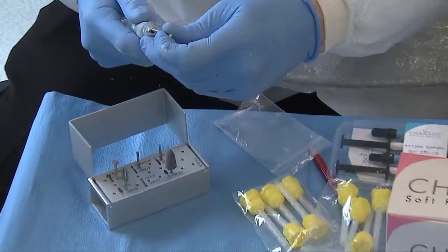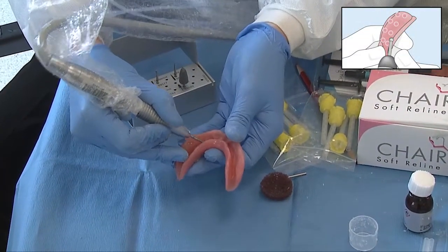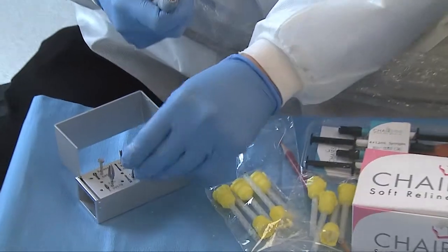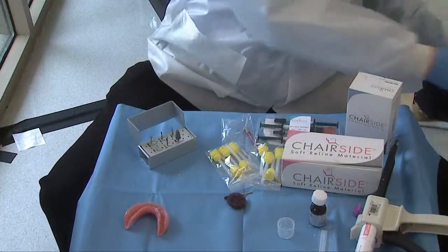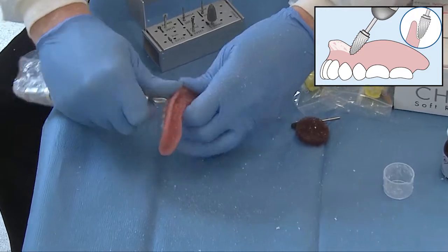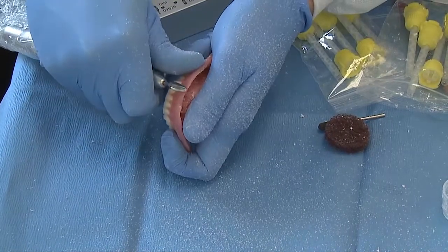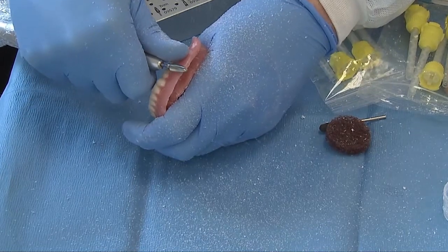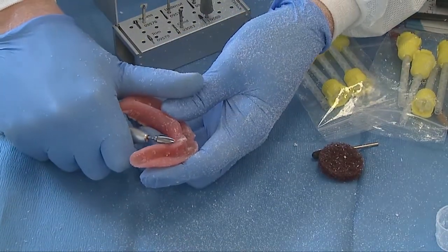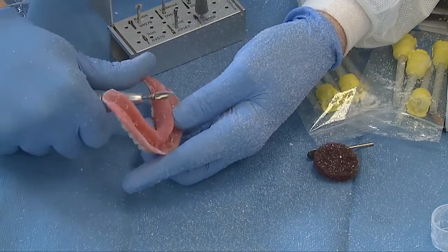We're going to take out our grind burr, which will allow us to create little tiny dimples on the inside of this complete denture so that our soft liner holds into place. Taking the grind burr away, we can put on our trim burr. At this point, we're going to use our trim burr to create a little bit of a bevel around the outside part of our denture, same thing on the intaglio and the lingual slope, so that way it creates a nice finish line for the patient.